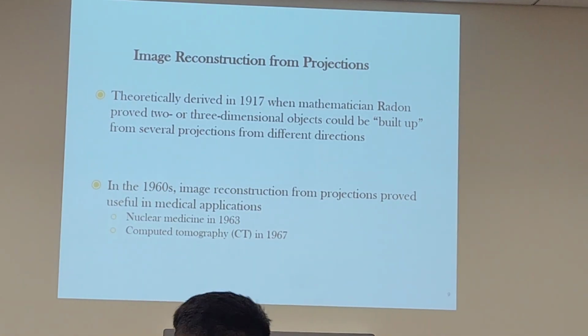Oh, okay. Yeah, mid-sagittal and obliques. You could go sagittal, coronal, whether it's this kind of coronal or if it's this kind of sagittal, it doesn't matter. You can reconstruct it anywhere as long as the data was acquired. Now, if I was taking a chest and I wanted to reconstruct a leg, can I? Is there any kind of math, James, that's going to help me reconstruct the leg out of scanning a chest? Absolutely not. Why?